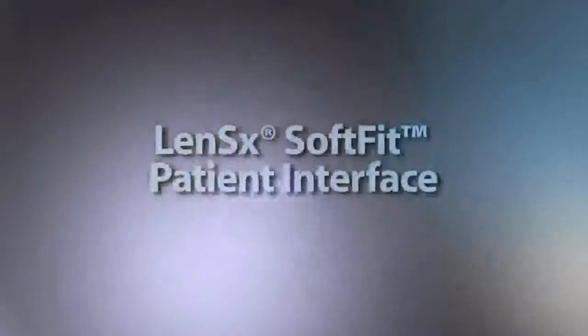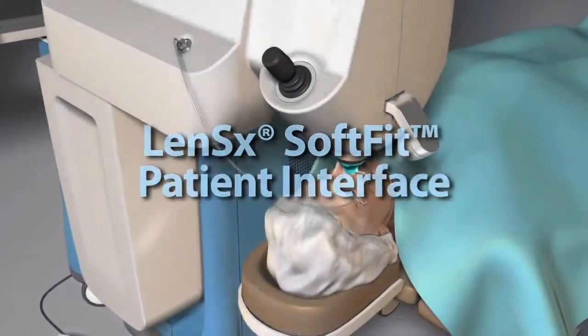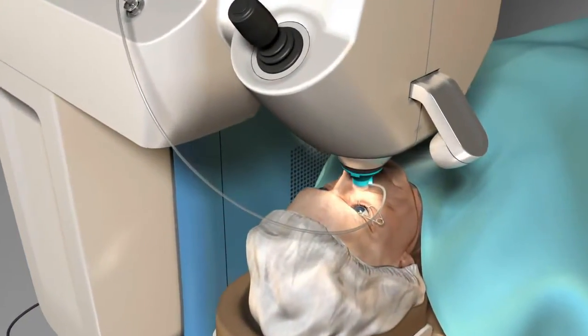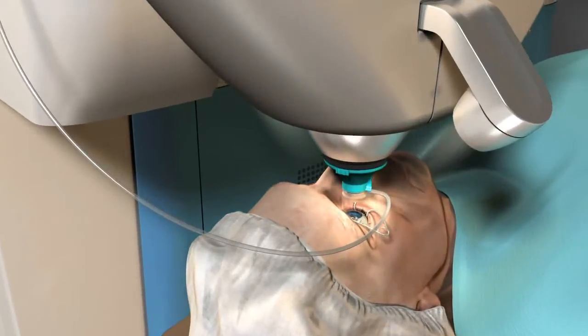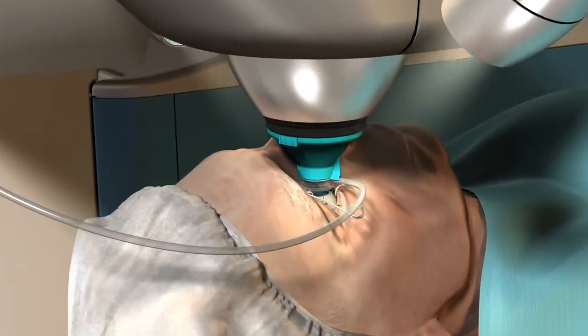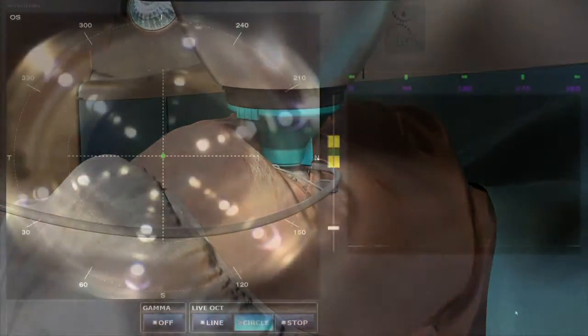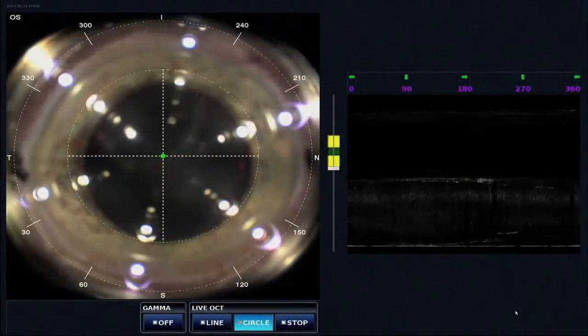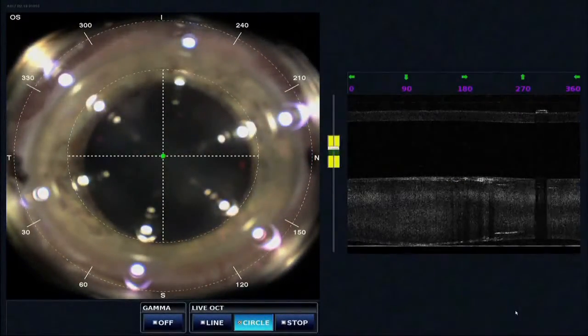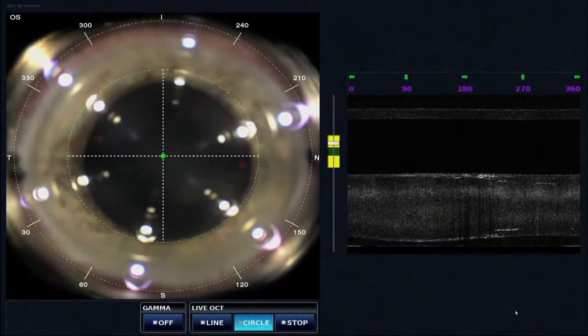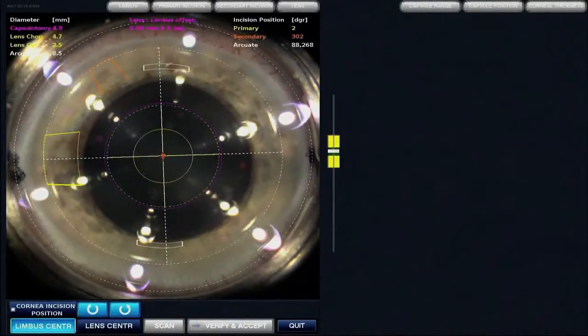The new Alcon LensX SoftFit patient interface enables simplified docking, especially in small and deep-set eyes. The patient relaxes as the surgeon utilizes the high-resolution video microscope and live HD OCT image to efficiently guide and dock the patient interface to the corneal surface.